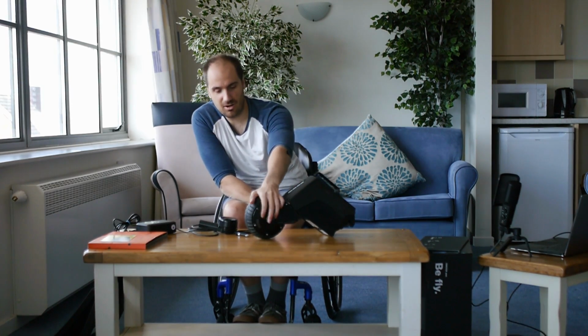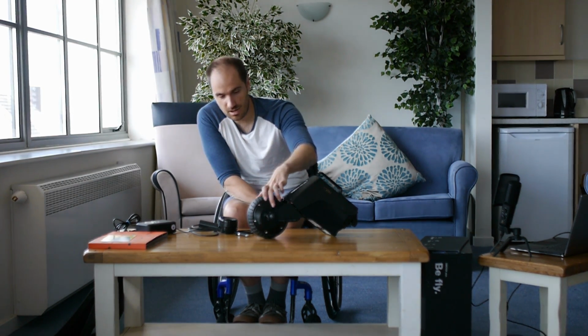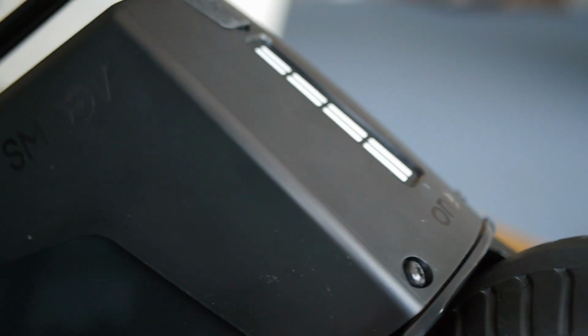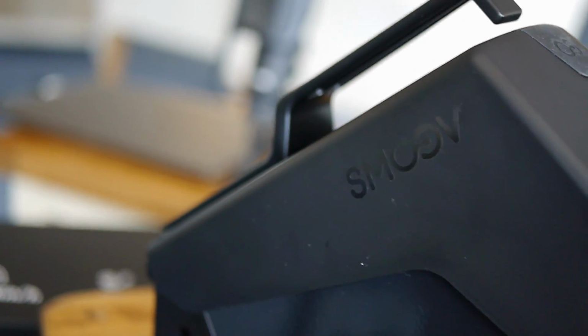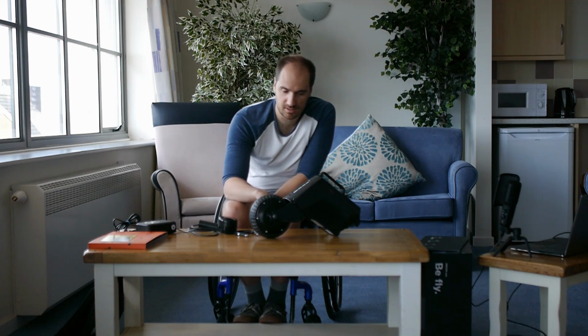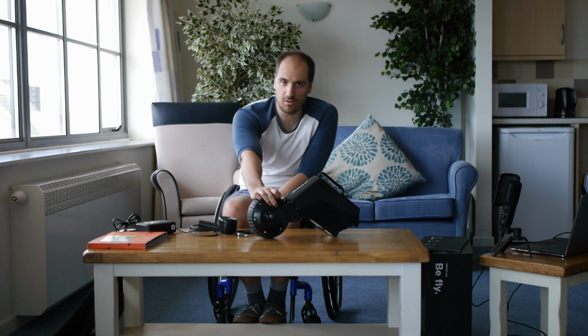Now, as I said, at the moment, SmartDrive dominates this market. They have quite a unique wheel design where the wheel goes that way and that way. So the wheel itself doesn't turn, but the tyre on, it's very hard to explain, but you've probably seen it. Instead, this one is a lot more of a simple design, which is probably better for some reasons and not so good for others. But in terms of simplicity and probably being able to replace it and repair it, this is probably a lot easier to do. So, a big fat tyre at the back, which is going to give you a bit more grip, which is probably going to be better. And it swivels on a point here. So that's probably where most of that weight comes from, because you've got this big, heavy swivel unit. So quite a lot of the weight's down the bottom, which is actually probably not as bad as you think it would be. You think, oh, light is better, but in terms of traction, the heavier wheel is probably going to be a better thing.